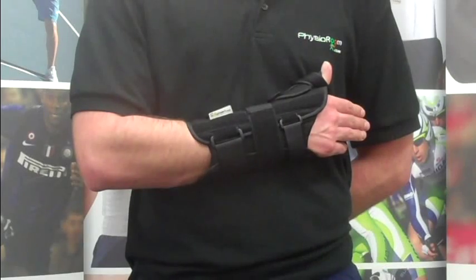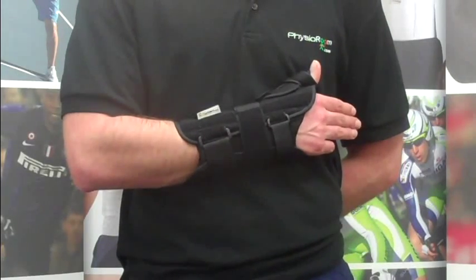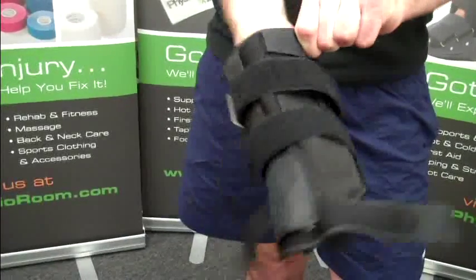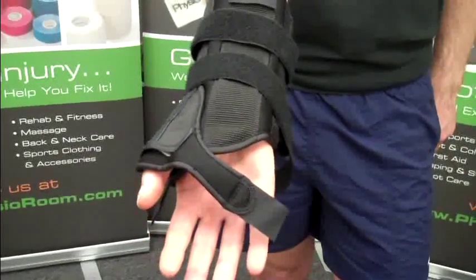The PhysioRoom.com Wrist Brace with Thumb Splint is an adjustable, lightweight cast which protects the wrist and thumb following fractures and sprains. This removable product can be used as a splint and is ideal for use on healing wrists and thumb ligament injuries and after surgery.